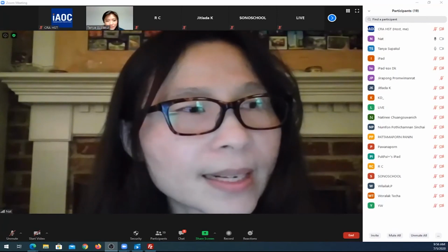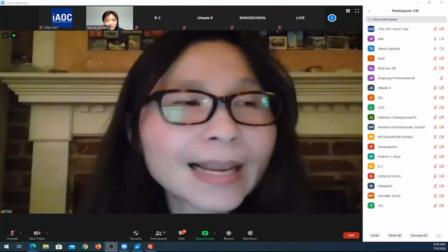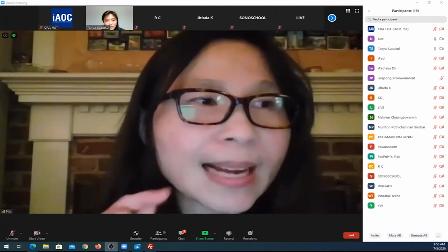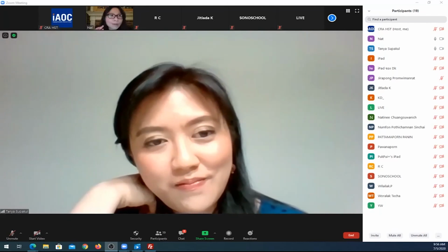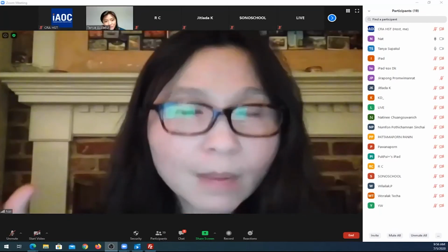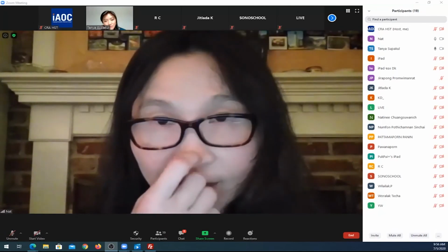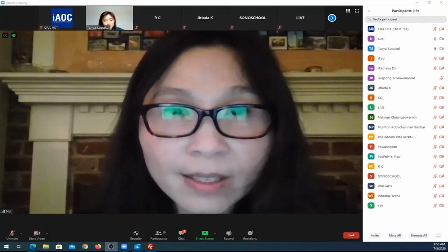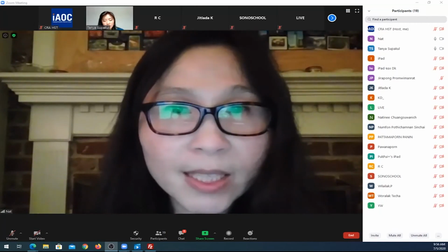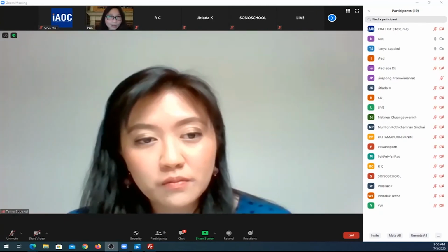I think the decision to make is like I told you, that we set the threshold at 120 to 150, but that's not always true. If your scanner is really good and fast, like the Siemens Force, dual energy, third generation, which just came out in 2016, the scan is so fast you can do it at 100.